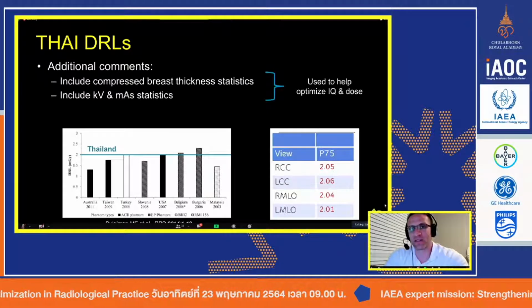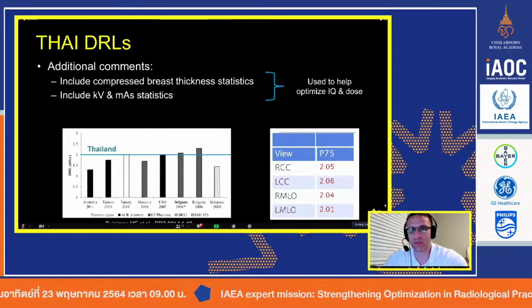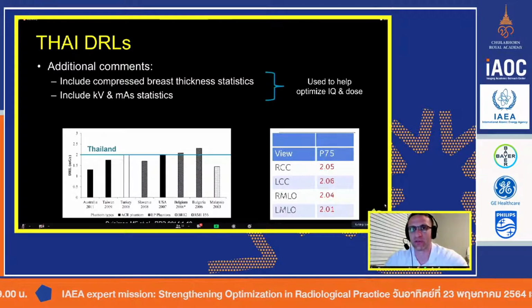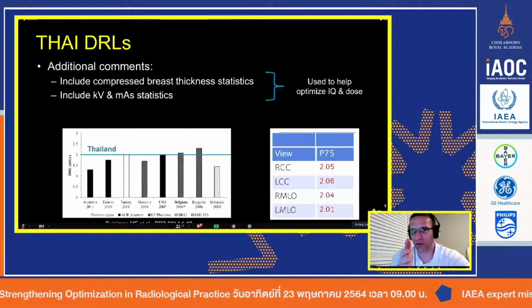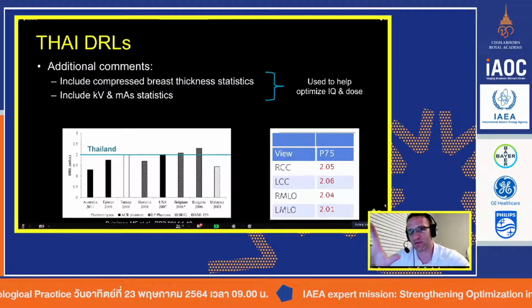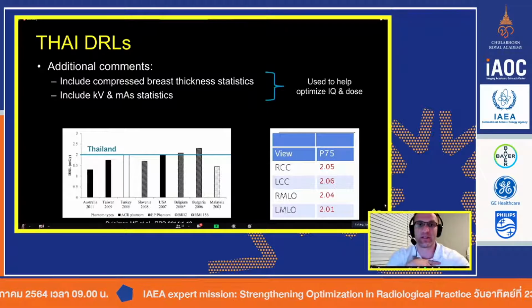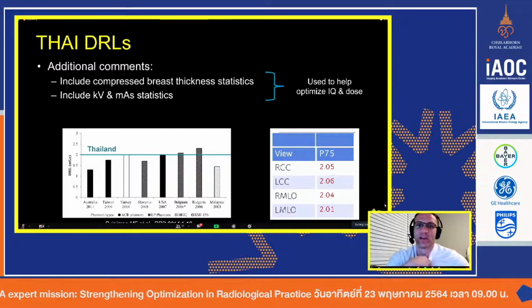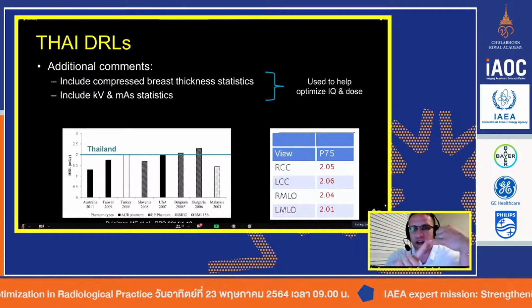I would say based on the scientific literature, as I've looked at the landscape, most people are reporting that the tungsten rhodium combination gives really good image quality for a good dose. Like I said, I'm not saying that the Molly or the Molly rhodium is bad, but from what the scientific literature is saying, it's trending that way. So if you asked me right now as a medical physicist, if my radiologist came to me and said, hey, we're going to buy 2 or 3 new mammo units, what would you suggest? Right now, I would say tungsten rhodium.